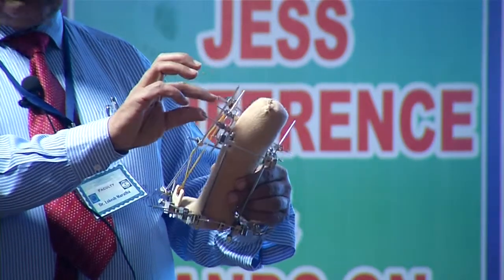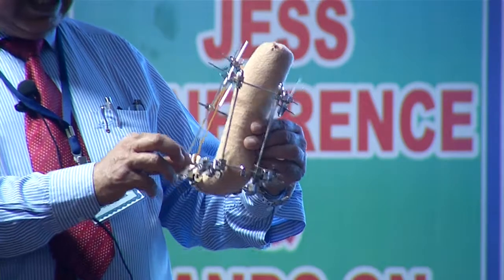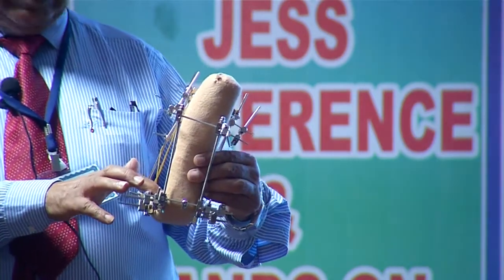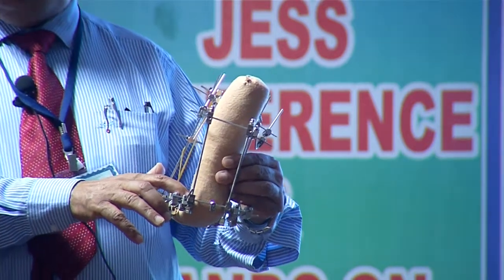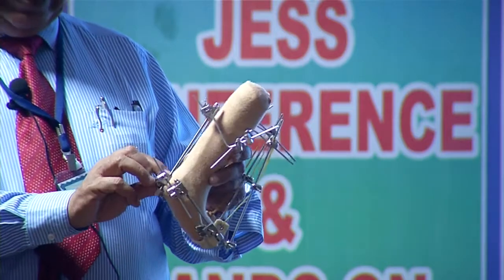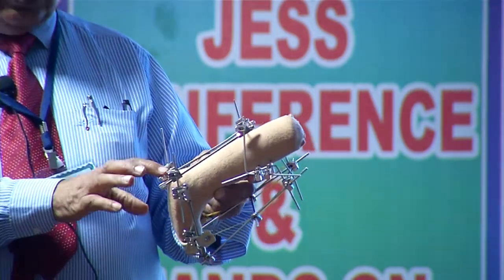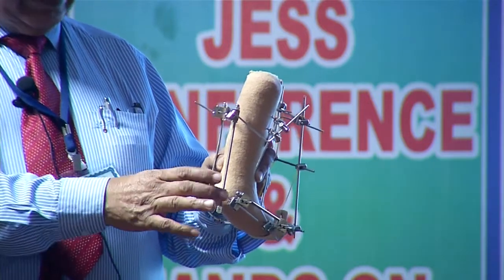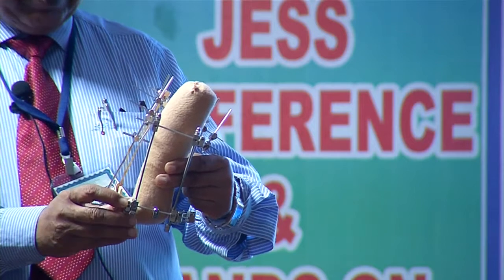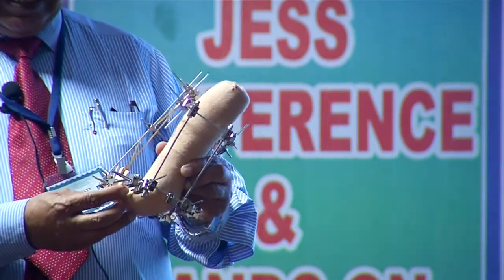Use three K-wires on the proximal part of the tibia, two K-wires medially and two K-wires laterally on the metatarsal, and two K-wires transfixing the calcaneum. Transverse K-wires — always take care of the neurovascular bundle on the medial side posteriorly. Use two straight rods to make the construct on the calcaneum posteriorly.